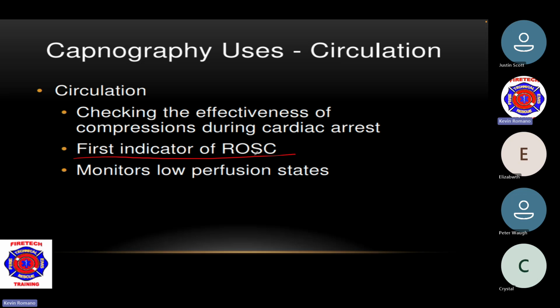Some of the things we're looking for with this is low perfusion states. We're going to cover that more later on in the presentation. But again, it checks your effectiveness.